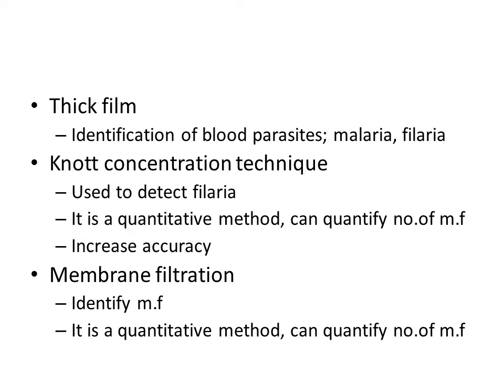But in the case of a thick film, we are adding more than 1 drop, 2 or 3 drops. That means it increases the chances of finding the parasitical stages. When we are taking more sample, sometimes there are more chances to detect the parasitical stages.